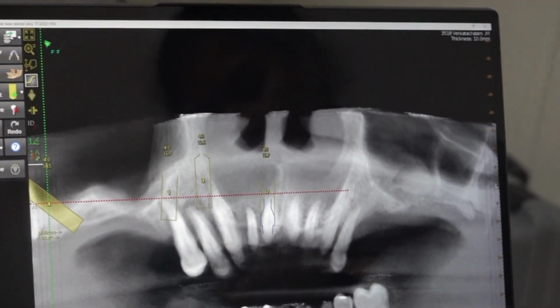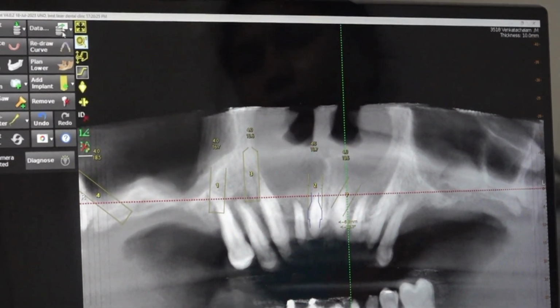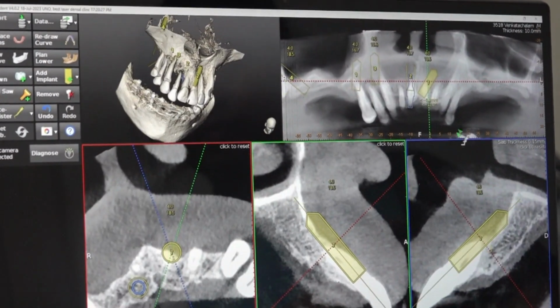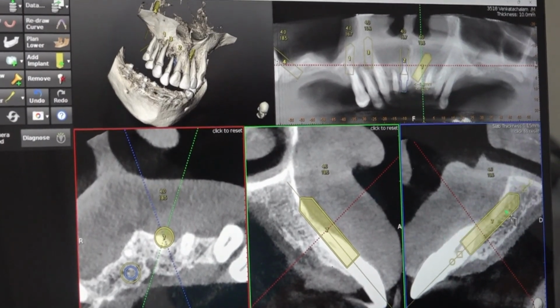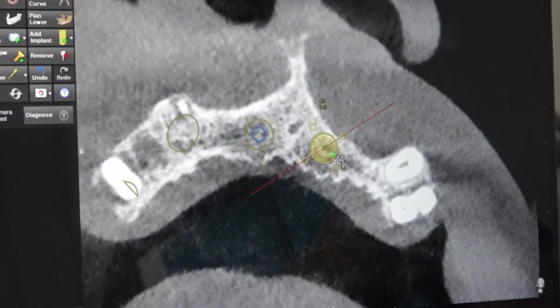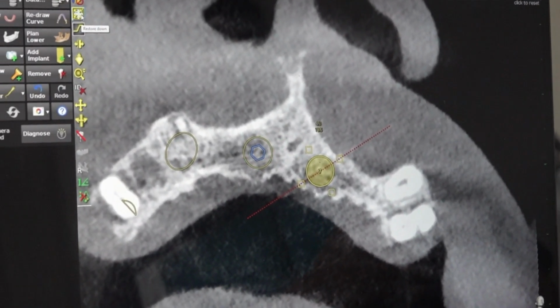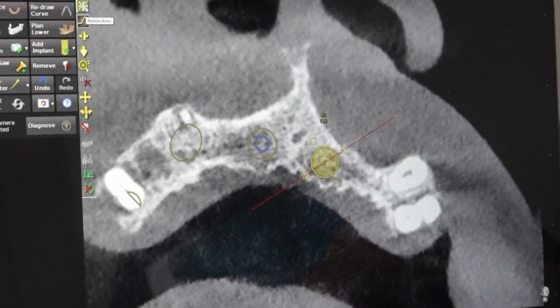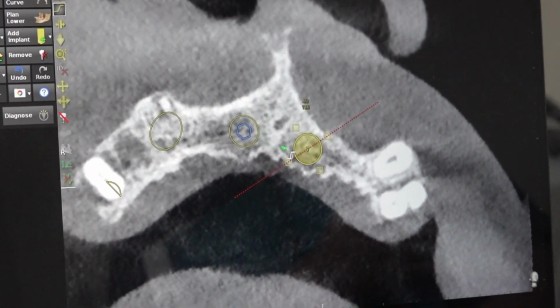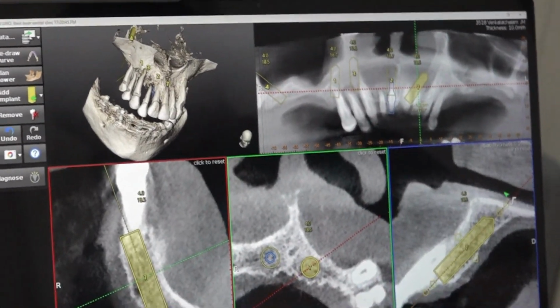Now we plan for the left side, 2-1. Always place 1-1, 2-1 implants. They are key implants. That's what I told. It's easy to plan now, placing here. See, the nasopalatal canal is not very big in this patient, which is lucky. Imagine if this nasopalatal canal itself is very big, we have less bone for our implant.